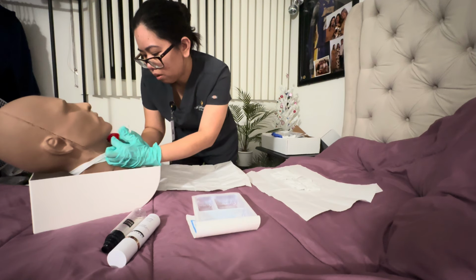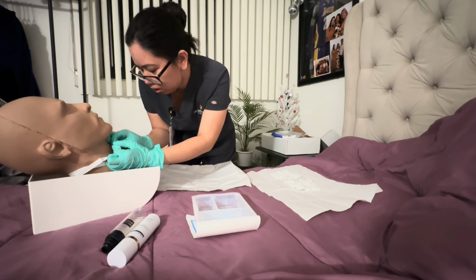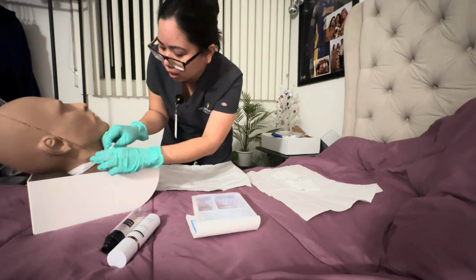Okay, and then we're gonna secure it onto the other end, and we're gonna do a tie.